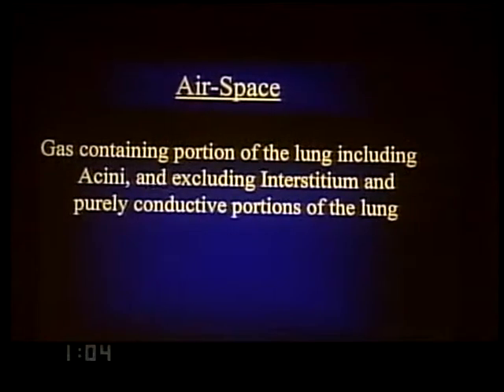My talk will be on the airspace diseases, and as with the talk on interstitial diseases, I'm going to commence at the very beginning by defining what an airspace disease is and why it is that it looks the way that it does, and hopefully how one may differentiate among these things.